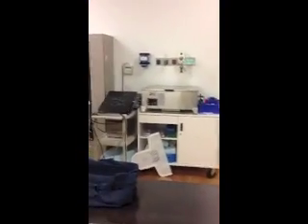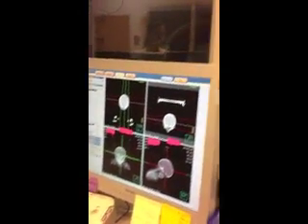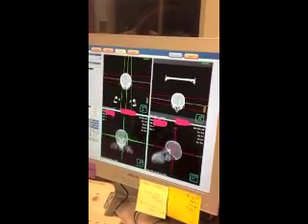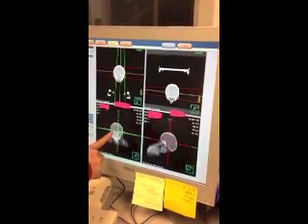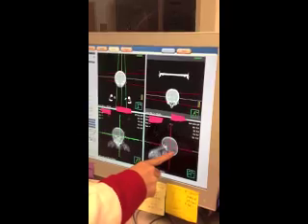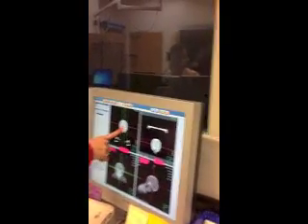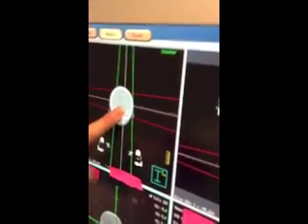The next step we will go to is the software. We will then import the diagnostic scan that was just taken into the software planning system. And it'll look such as this. This is what we call an axial view, and this is called a coronal view. And then you have your AP DRR, which we will discuss in a minute, and a right lateral DRR. And this right here, the green spot that you see, is where the physician decided to localize the isocenter that I spoke of earlier.